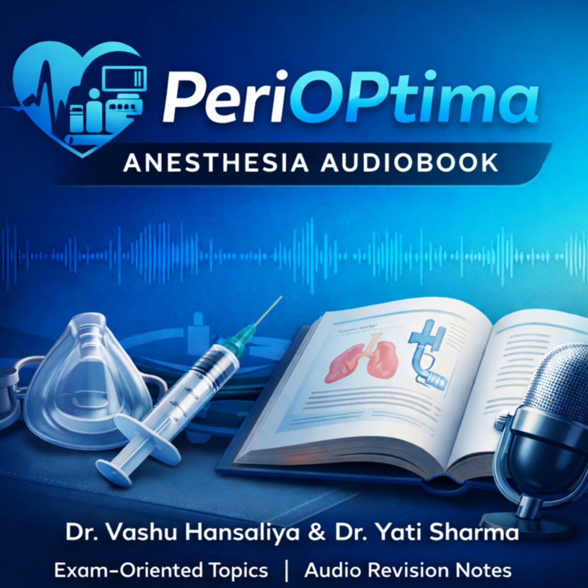It's actually a great monitor for CPR quality too, isn't it? If you get the ETCO2 above 20 mmHg, you're doing good compressions. Correct. It's a circulation monitor as much as a ventilation monitor. Don't forget, it's also used for dead space calculation, Bohr's equation. Keep that in your back pocket for the physiology viva.